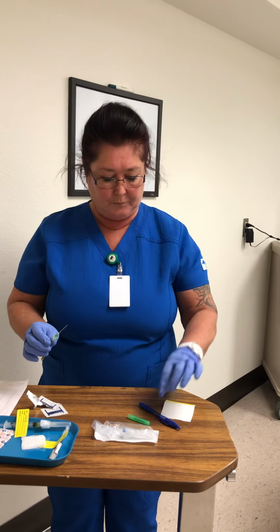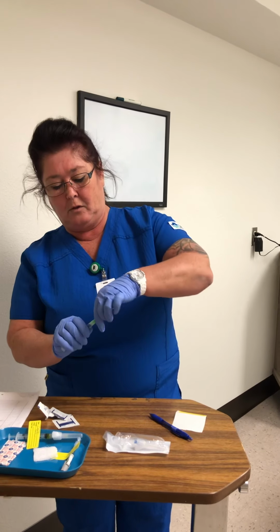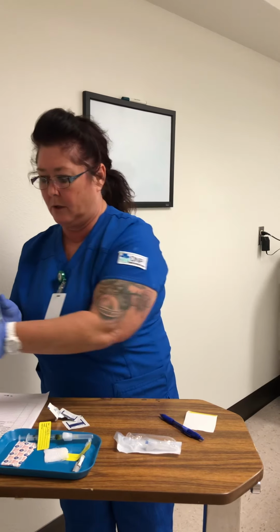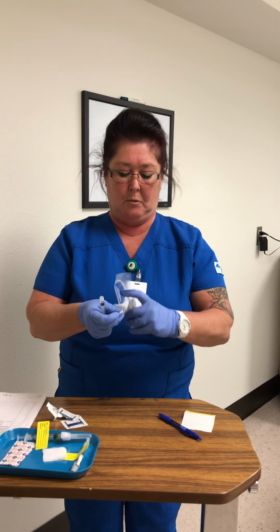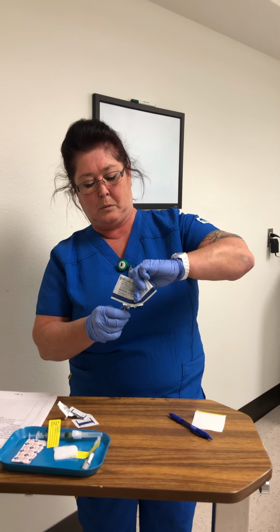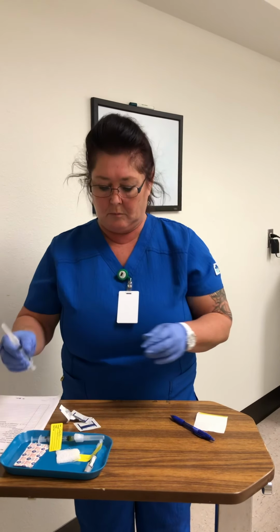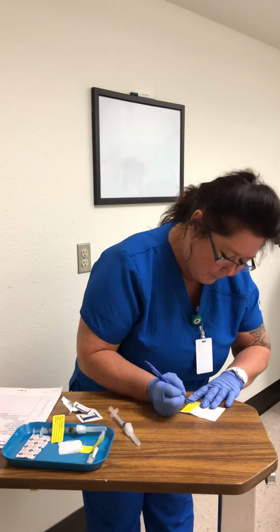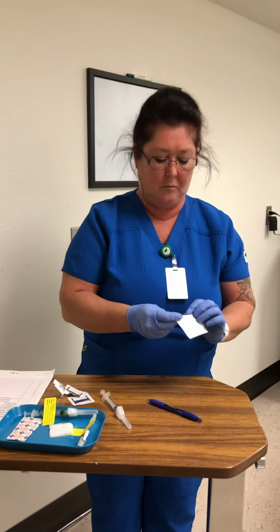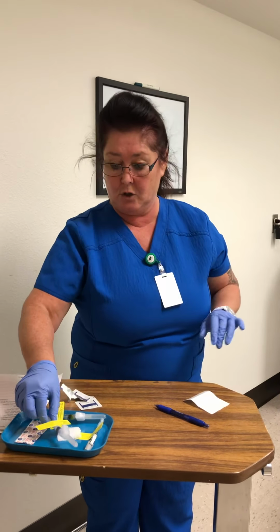I am going to take this one off, discarding in a sharps container, and I'm going to attach my injection needle. And then I will label this one. Okay, so now I have all of my injections drawn.